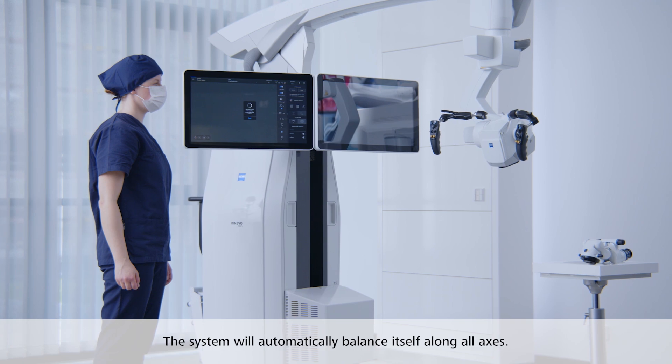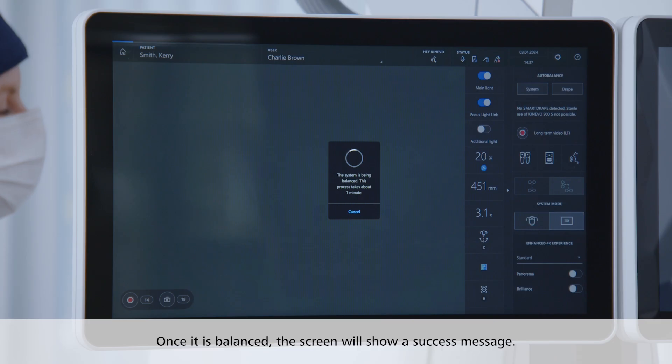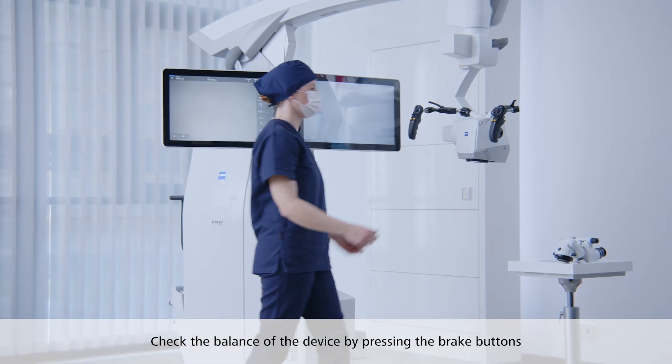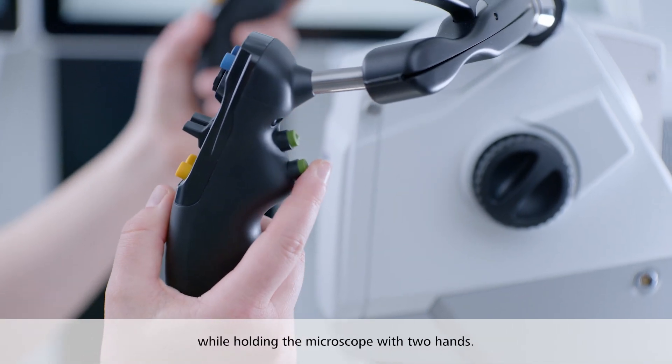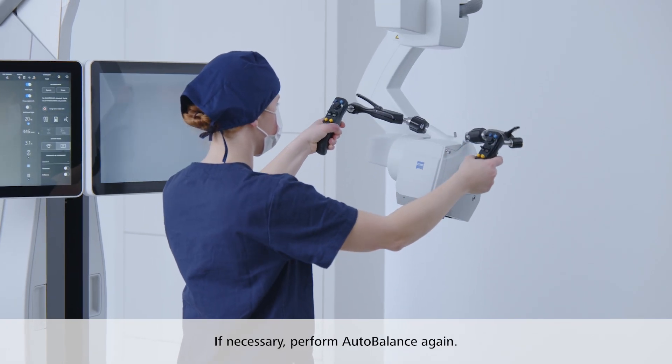The system will automatically balance itself along all axes. Once it is balanced, the screen will show a success message. Check the balance of the device by pressing the brake buttons while holding the microscope with two hands. If necessary, perform Auto-Balance again.